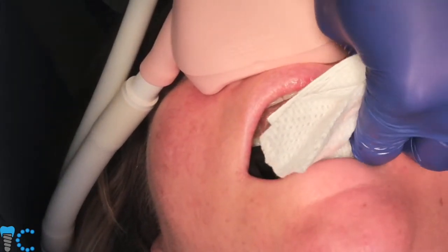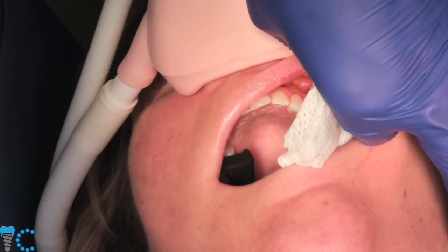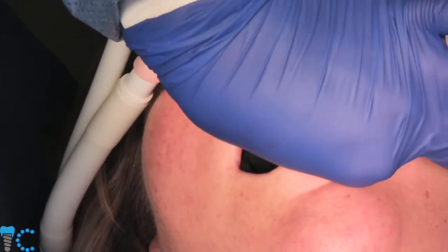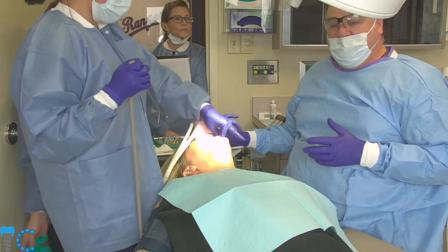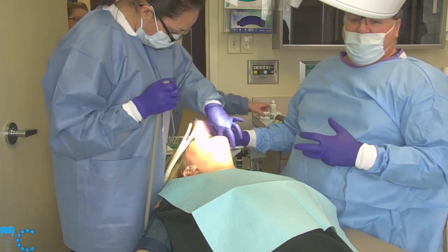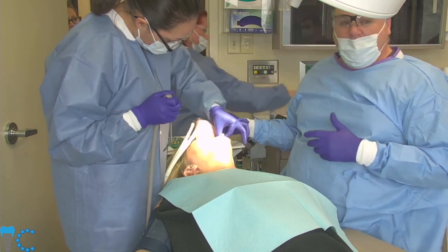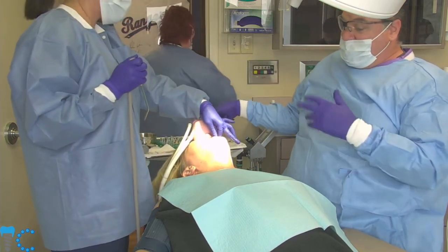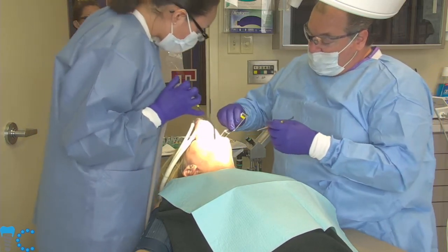And the other thing I would tell you about these implant surfaces is they are very impervious to hygiene methods. I don't think you want to use an ultrasonic scaler around them. I think that would be a bad choice. But one neat thing is you can use a laser or an electrosurgery unit around these, because ceramics are very poor conductors of heat and electricity, and that's not true of titanium. So another advantage of these, if you want to laser recontour the soft tissue around it, go for it. If you want to use an electrosurgery unit around it, go for it.